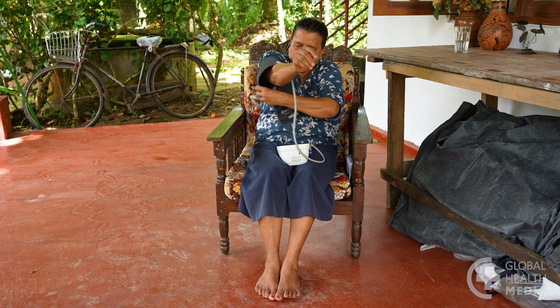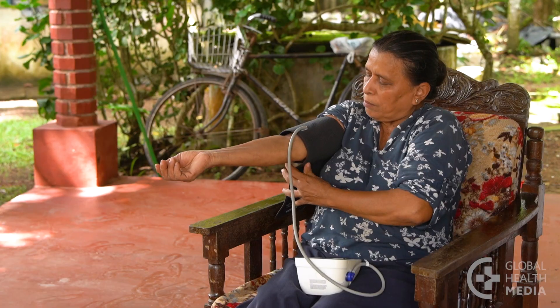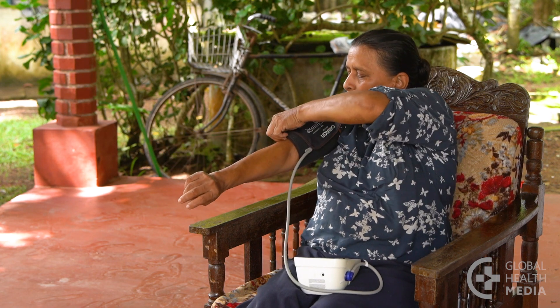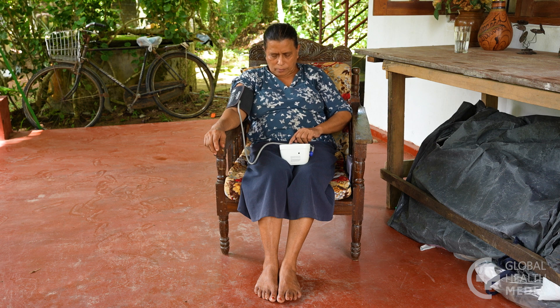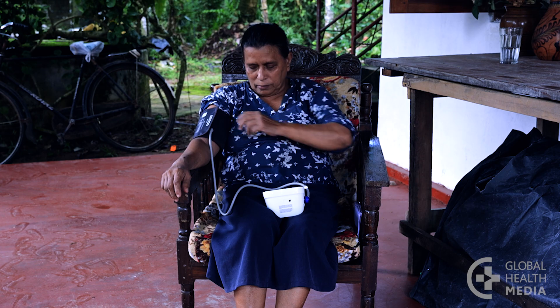Determine your blood pressure range by checking it twice a day for at least a week, and then check it periodically. Take the first measurement in the morning before eating or taking any medications. Take the second measurement in the evening before dinner.